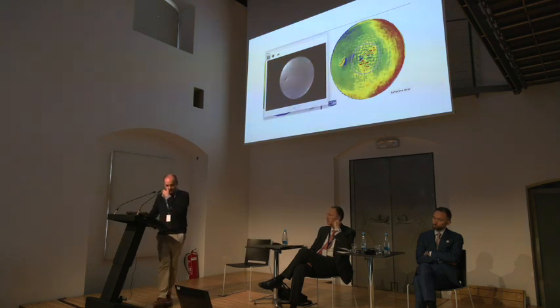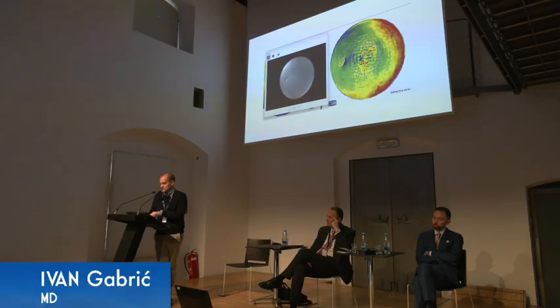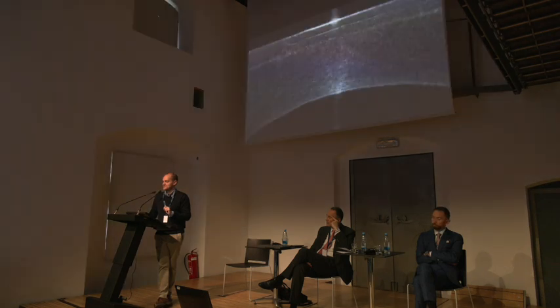This is a case where my colleague was doing lenticular surgery and she used a very sharp tool, poked a hole, and left a little fragment of the lenticule inside the space. You can see here on Osiris the little scatter that's created, and you can see the little lenticule fragment there on retroillumination. Let's try to find it on MS-39.